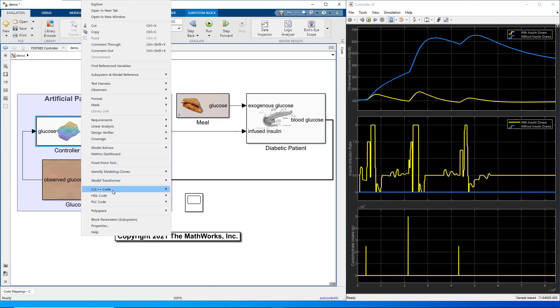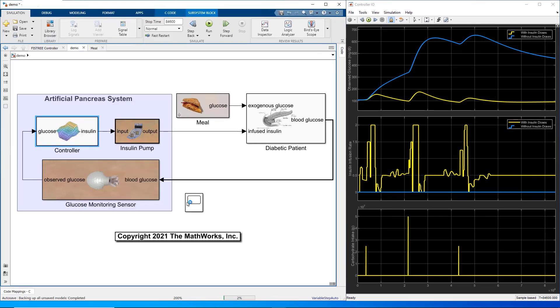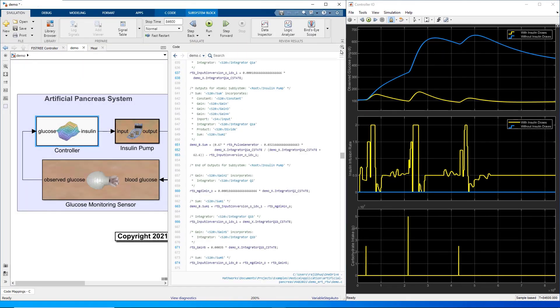Once the model is ready, you can generate code and deploy it to a target device. This concludes the demo. Thank you for listening.